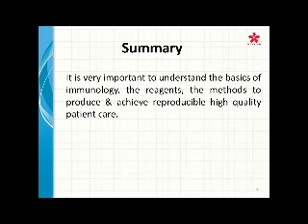So if you go back into your laboratory after this presentation, look at some of the abbreviations that we talked about: the horseradish peroxidase, the alkaline phosphatase, the DAB, the AEC, the monoclonal, polyclonal, rabbit monoclonal, the Ig subclasses of the antibodies, the IgE, IgD, IgM. You're going to see all of these terms in all of your reagents with immunohistochemistry.